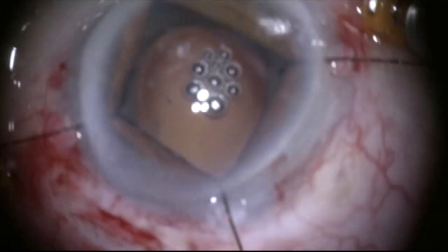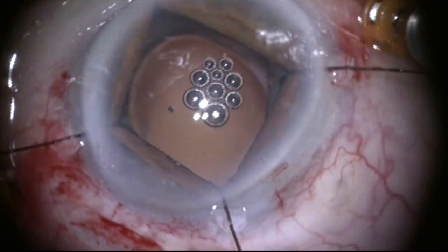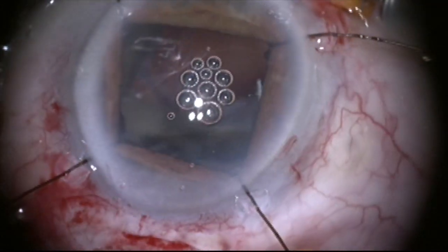I'm now going to grab the lens and bring it up where I can reach it from the anterior segment. Now it's apparent when I see this lens — and I've never really gotten a great view of this lens because this patient's pupil doesn't dilate well.